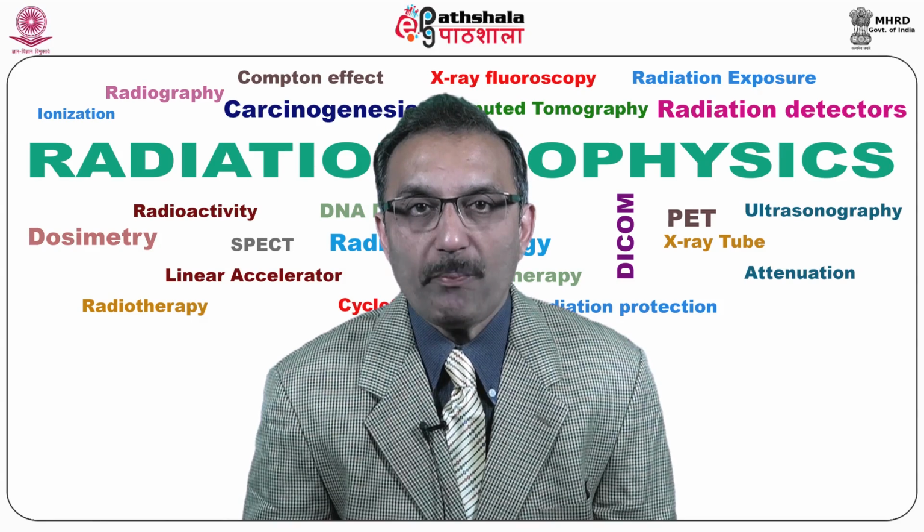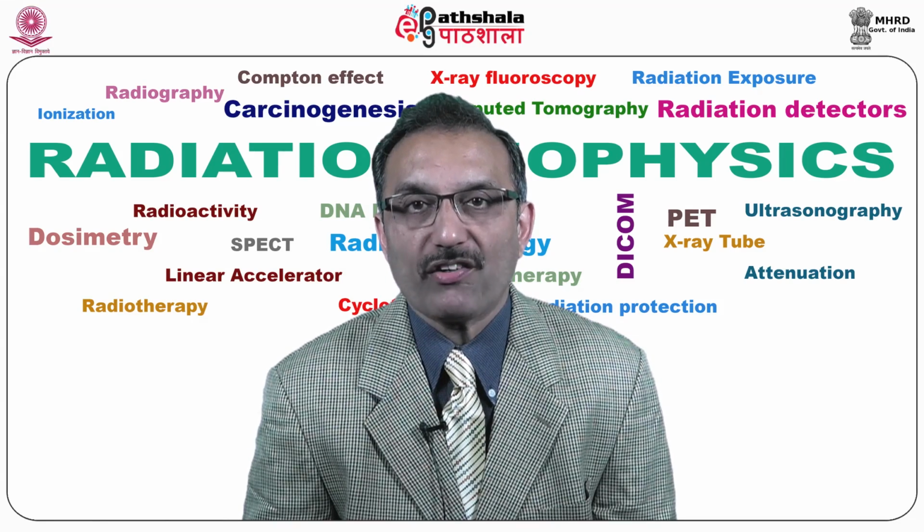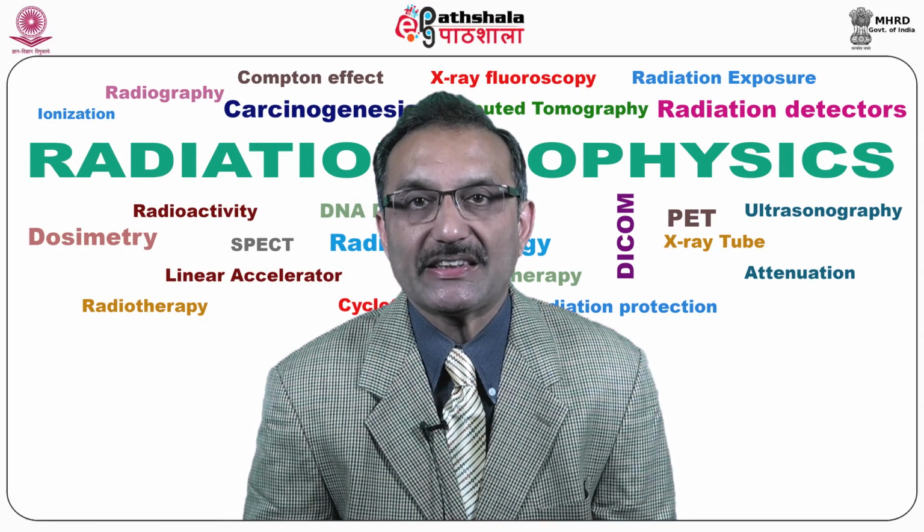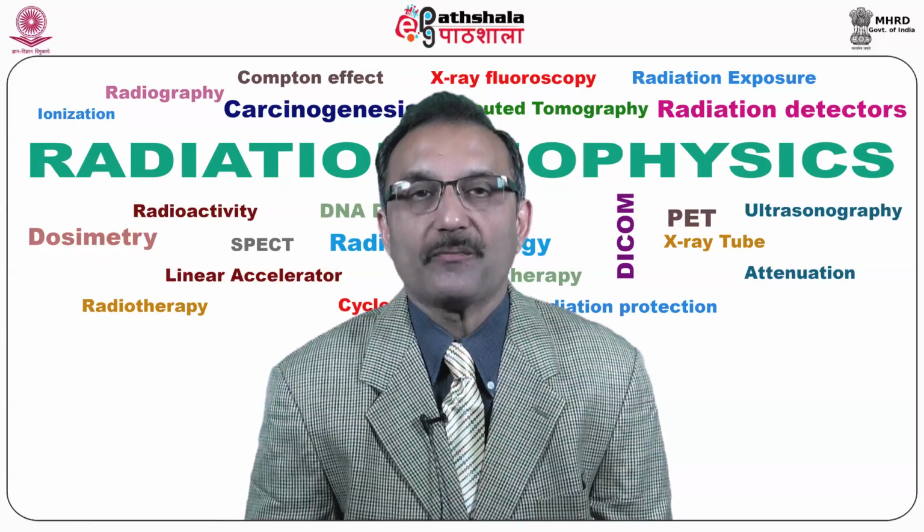Finally, the value of a PET scan is enhanced when it is part of a larger diagnostic workup. This often entails comparison of the PET scan with other imaging studies such as CT or MRI.